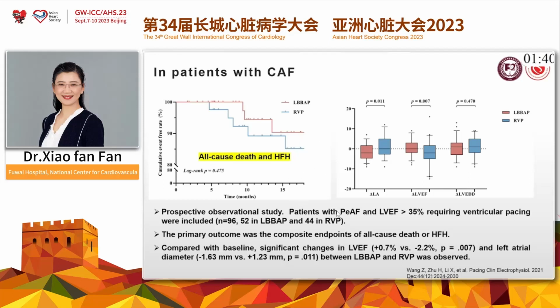And during almost 1 year follow-up, we found the primary outcome was comparable because most of these patients have LVEF over 35%, so the endpoint events are fewer.